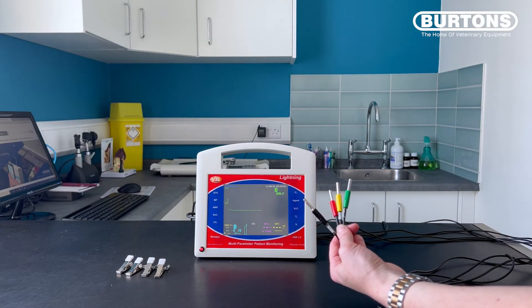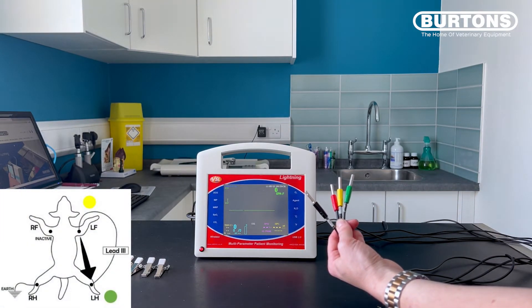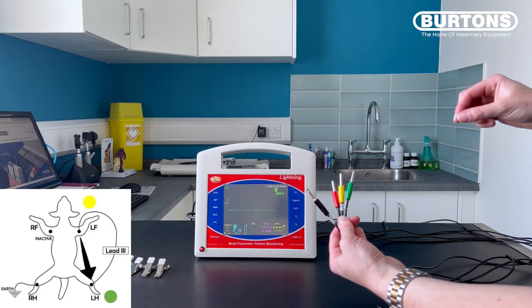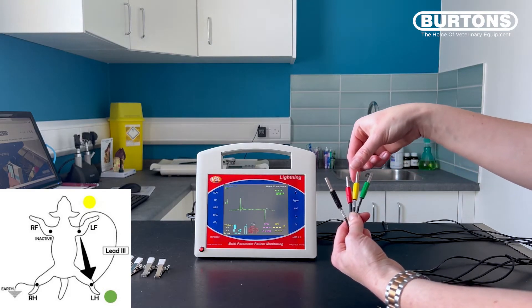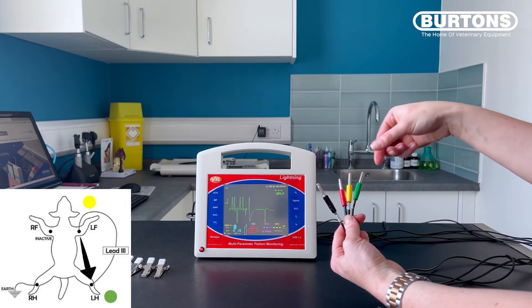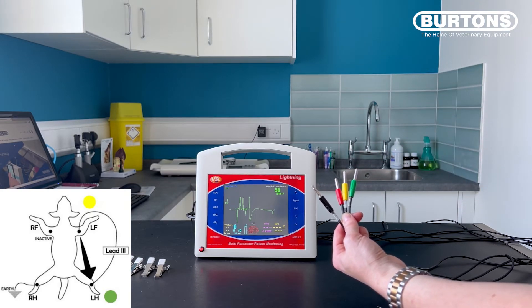In lead three, the active electrodes are green and yellow. If I touch them and introduce a signal, we should get interference on our trace. There should be no interference when I touch the inactive red electrode.